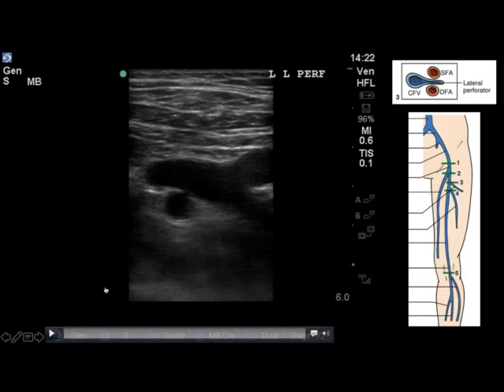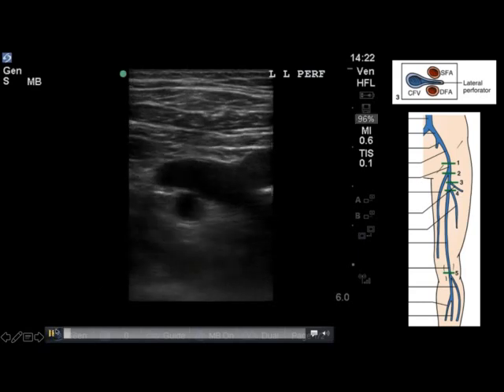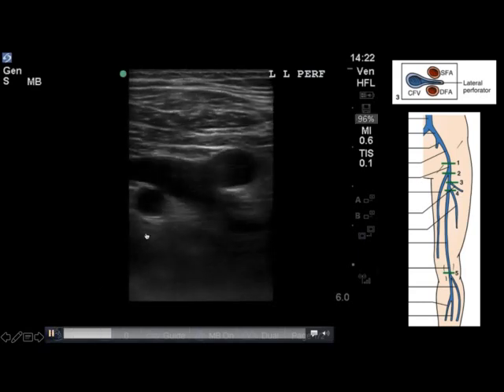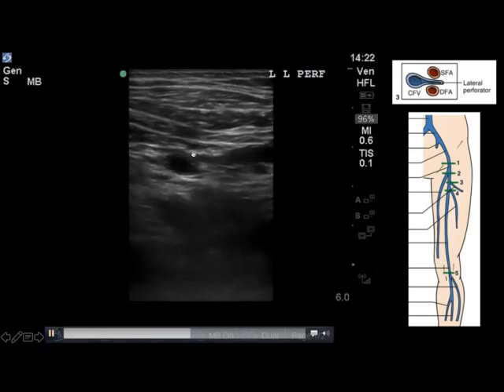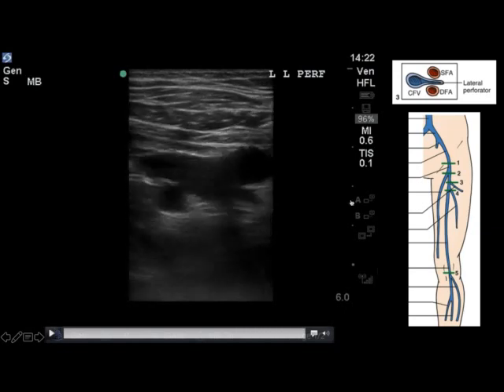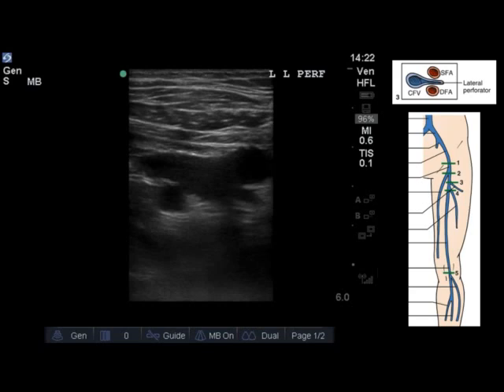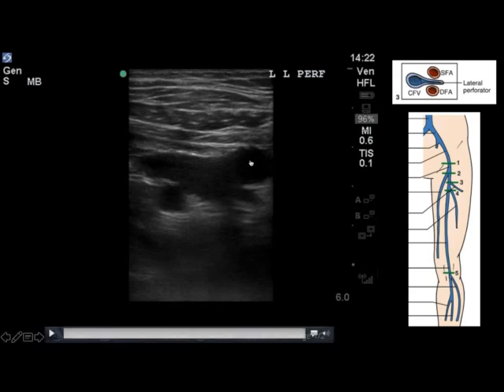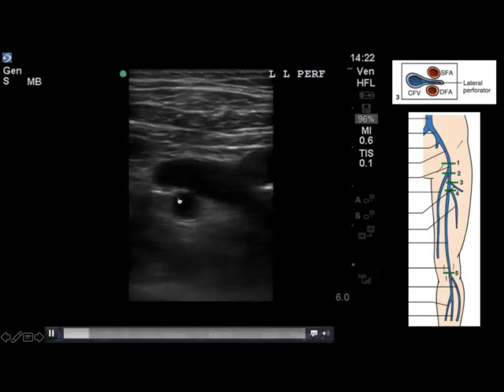Moving to the left lateral perforator — the left side of the screen is the medial side — you can see the lateral perforator moving to the right, or lateral side, of the screen in this cross-sectional image. You are able to see the superficial femoral artery superficial to the lateral perforator vein, and the deep femoral artery deep to the lateral perforator vein.